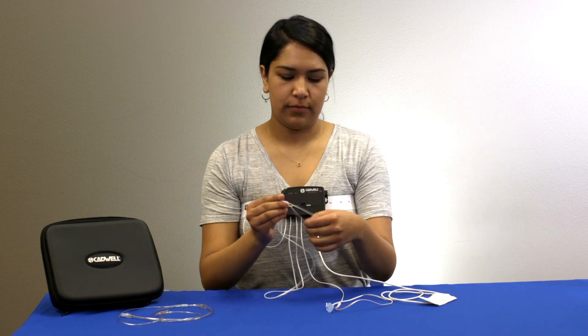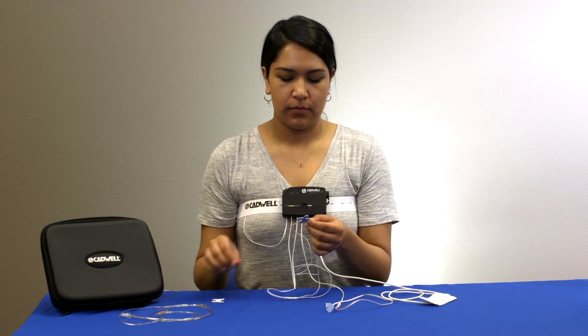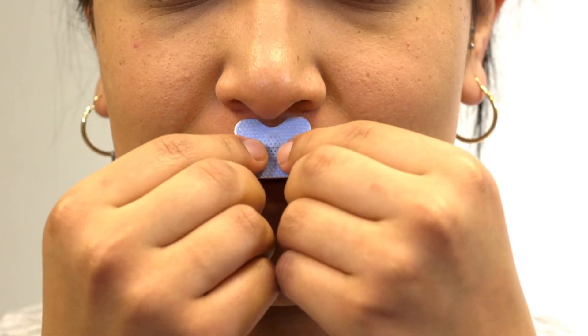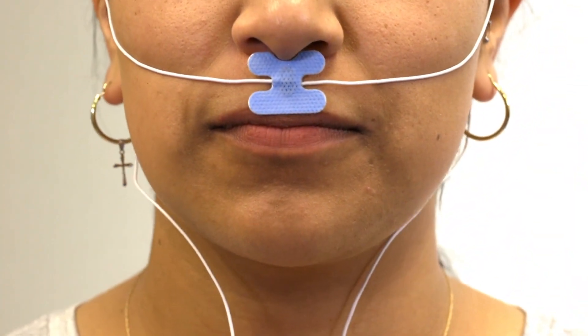Remove the adhesive backing from the thermal sensor. Stick the sensor on your face so that the notch at the top of the sensor sits just below the center of your nose. Then tuck the wires behind your ears.